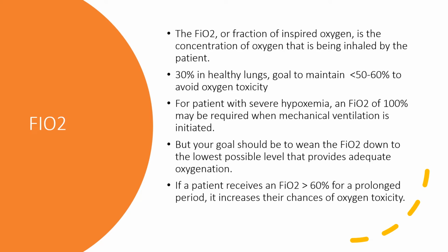The major problem with high levels of oxygen is oxygen toxicity, and this has become quite prominent these days. Oxygen toxicity results in CNS and pulmonary disorders. It could cause bleeding of the lungs, it could cause tremors, it could cause so many things. Think about this: when you have high levels of FiO2, you're increasing the free radicals in the blood, and this causes all kinds of inflammatory stuff. So the point I'm saying to you is, try to keep your FiO2 less than 60% in so many cases, and if they're not oxygenating well, utilize PEEP.